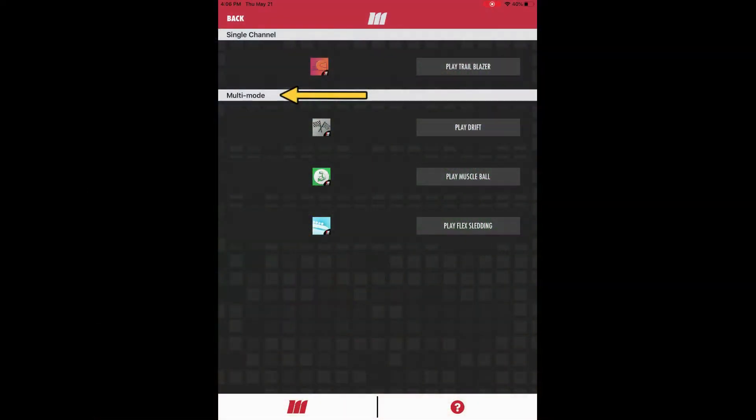In the multi-mode category, all games can be played in either single or dual channel mode, and Drift and Muscleball offer various levels of difficulty.